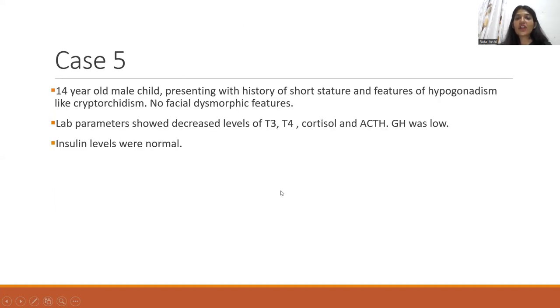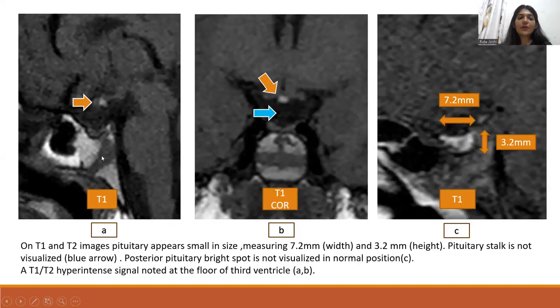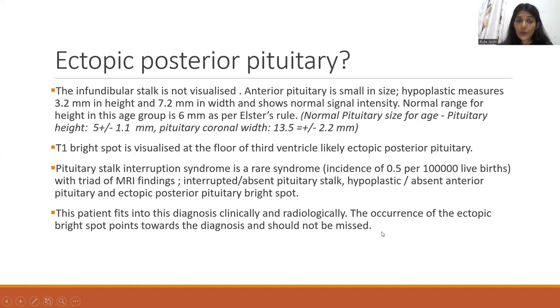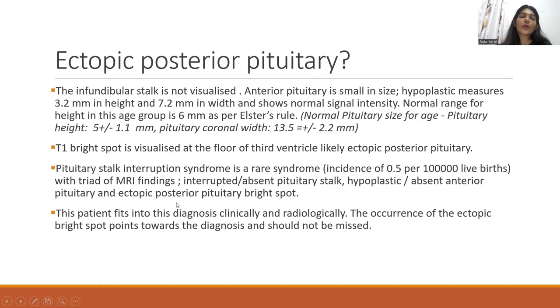Case 5 is a 14-year-old male child presenting with short stature, features of hypogonadism, low levels of T3, cortisol and ACTH; GH was low, insulin normal. The anterior pituitary is small in size, the stalk is absent, and there is an abnormal location of the posterior pituitary bright spot at the base of the third ventricle. This is an ectopic posterior pituitary, pointing toward pituitary stalk interruption syndrome — a rare syndrome with incidence of 0.5 per 100,000, with a triad of MRI findings: interrupted pituitary stalk, hypoplastic anterior pituitary, and ectopic posterior pituitary bright spot. The occurrence of the bright spot is diagnostic and should not be missed.